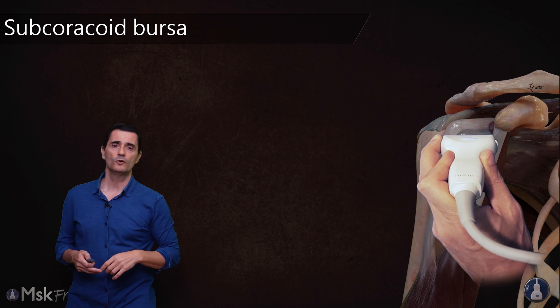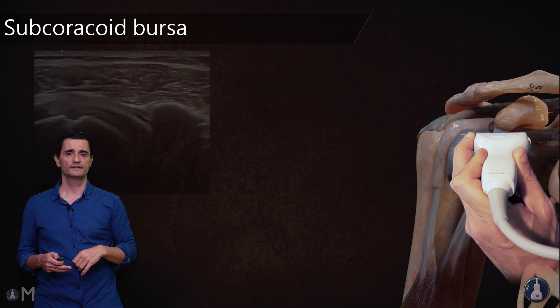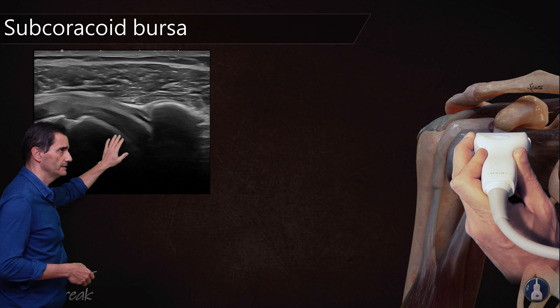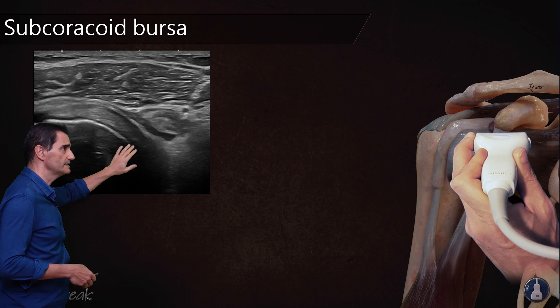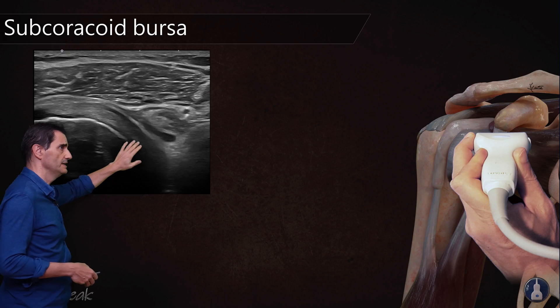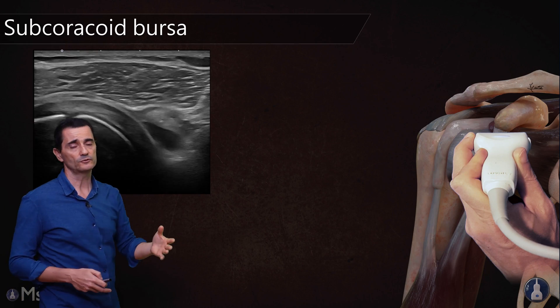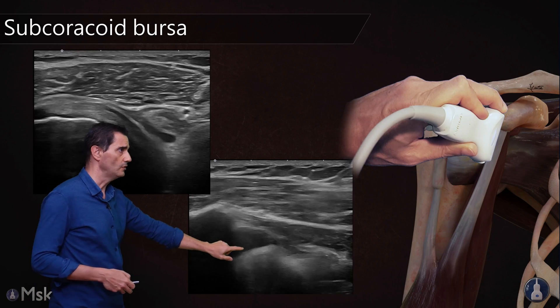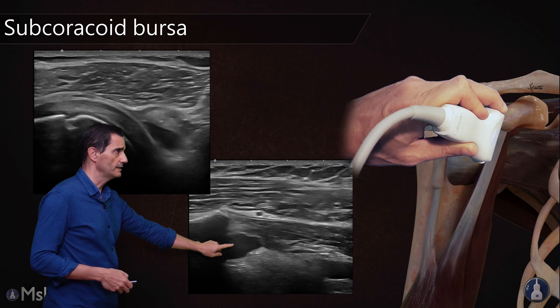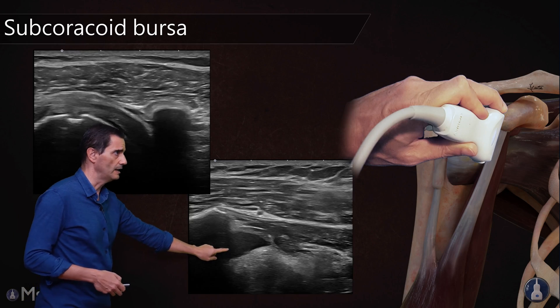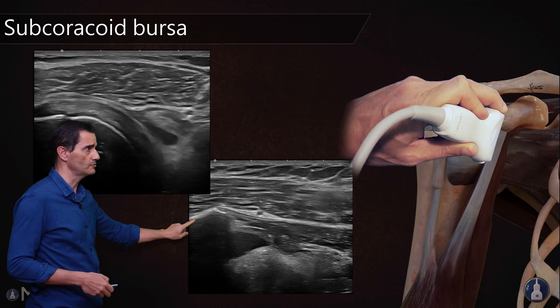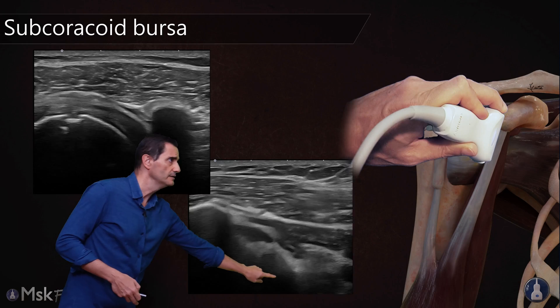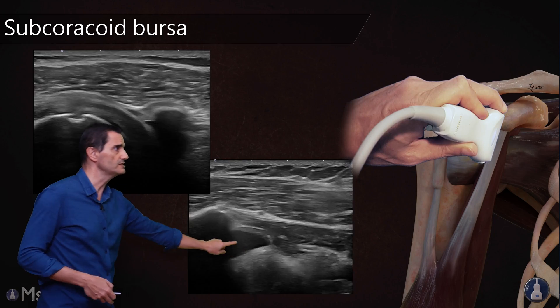If we place the probe and go over the coracoid process, we will see this small amount of fluid here. If we continue distal, this fluid disappears — it's no longer anterior to the subscapularis. In this long axis view, you can see a better view of the bursa going deep under the coracoid process. This is the coracoid process, this is the coracobrachialis muscle, and this will be the subscapularis over there. The bursa is located here.